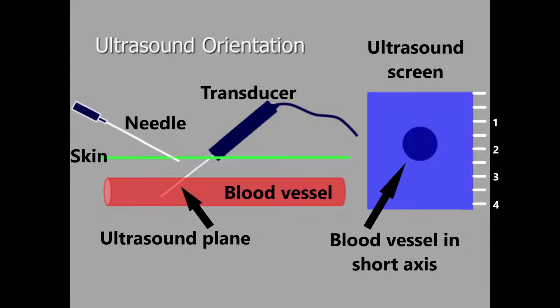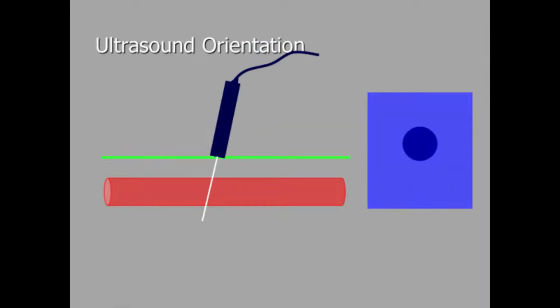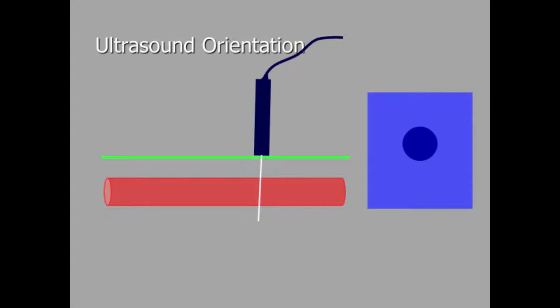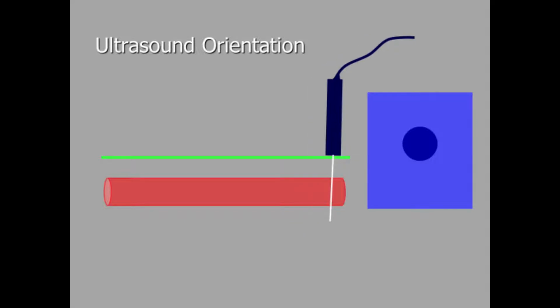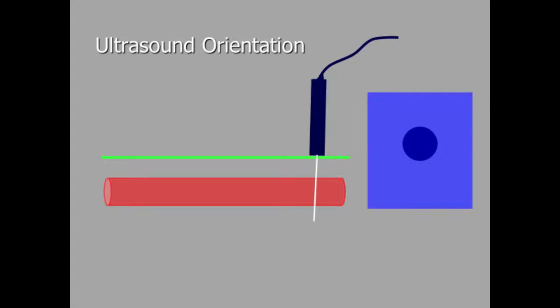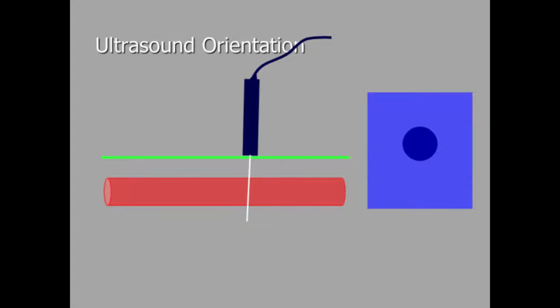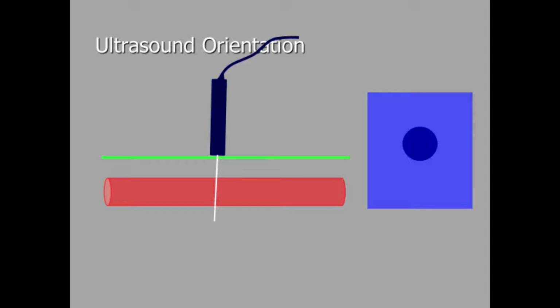Normally we should examine the whole structure, moving the probe proximal and distal to examine the whole vascular structure to make sure there are no clots, abnormalities, any thrombus or narrowing of the lumen. We want a vessel that is long enough to take the line that we're going to place. And note the tilting of the probe to examine more distally, especially if you are against a clavicle. And here we're moving up. Again, we examine the whole structure to make sure there are no surprises.